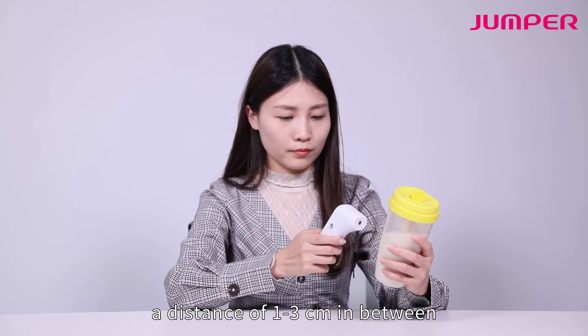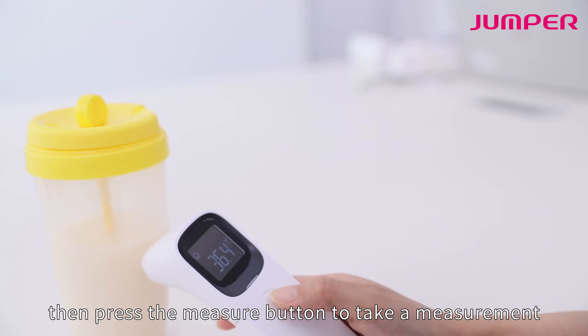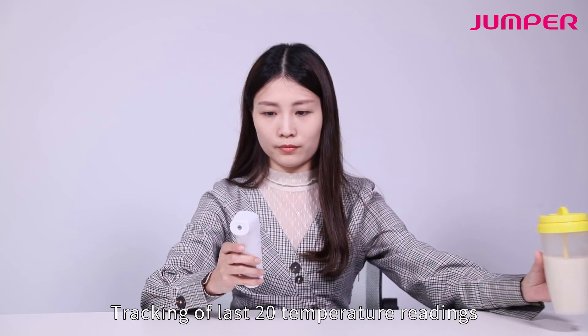For object temperature, switch the ear/head button to ambient mode. Point the temperature probe at the object with a distance of 1 to 3 centimeters in between, then press the measure button to take a measurement.